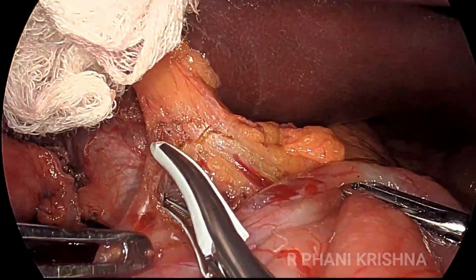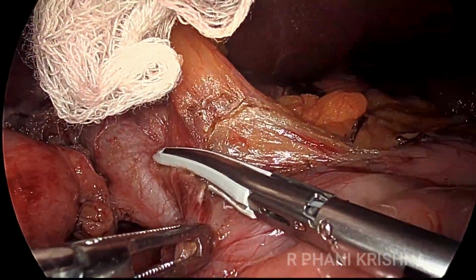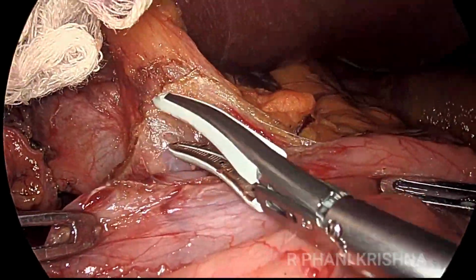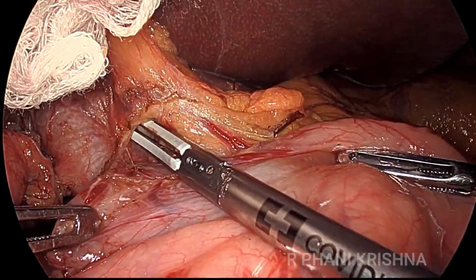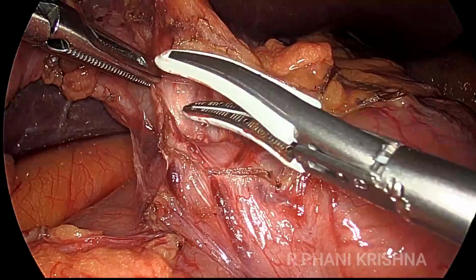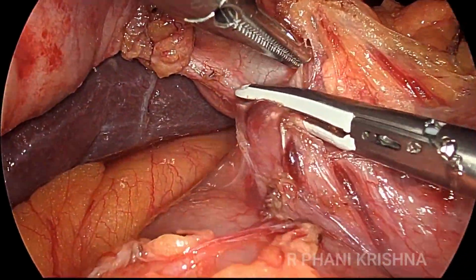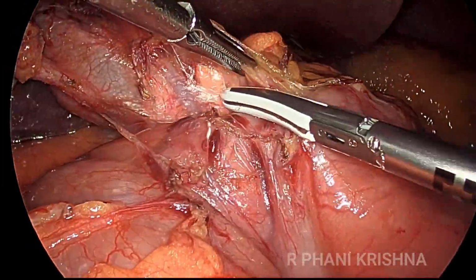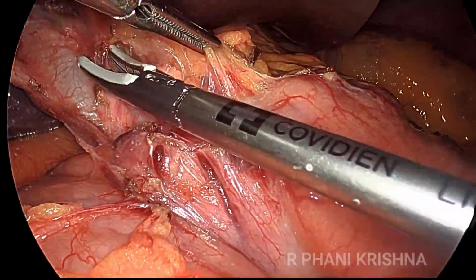So the first step in the lymphadenectomy is we go to the lower border of the hepatoduodenal ligament and divide the right gastric and the lower border of the hepatoduodenal ligament from its attachment to the upper border of the duodenum. Obviously, at this lower border, you'll have multiple right gastric branches. We will divide all of them.